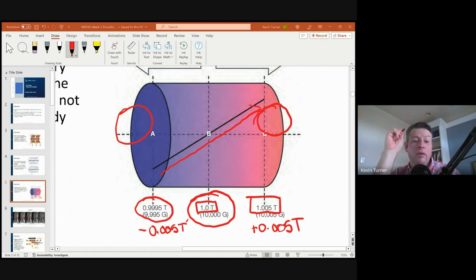No, Kathleen, because the gradients wouldn't be on. I'm talking about when you walk around the magnet when it's turned off, that's just the main magnetic field. Most of the time you're in the room, the gradients aren't on, right? You don't usually go in the room while the machine's running. You can, but it can cause artifacts and a lot of problems, so we try not to.